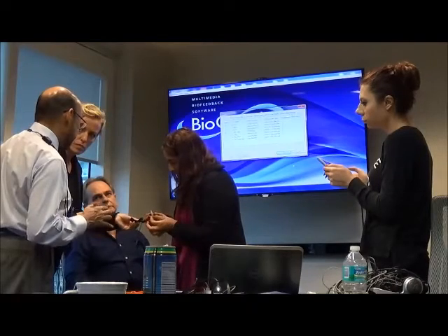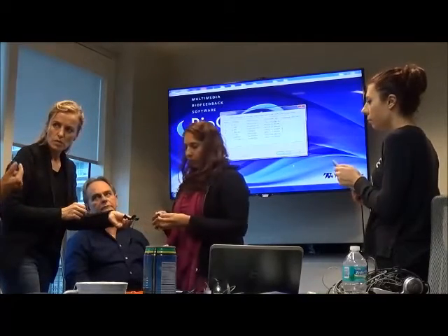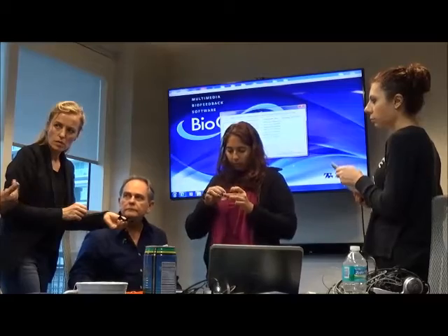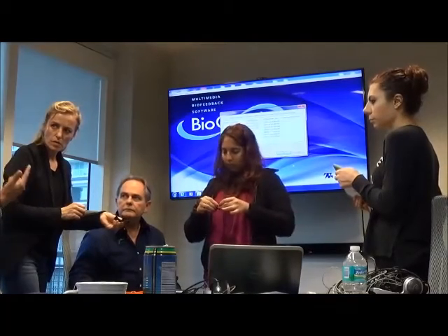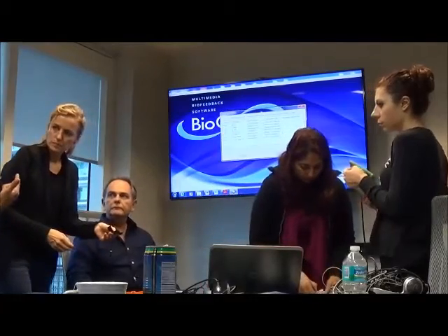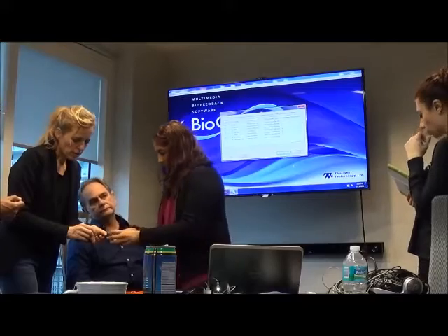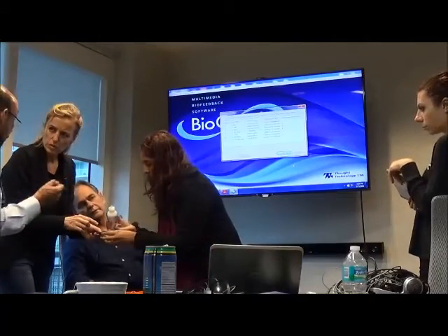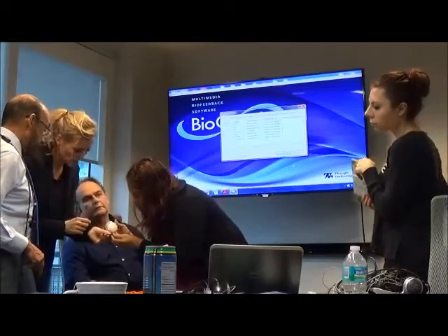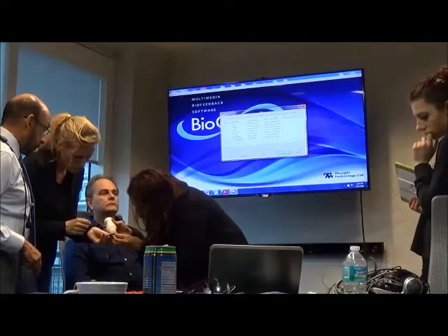It's a preparation which is silver and silver chloride. And this is a better conductive material. Oh, okay. So you have the base metal, and then you have a coating of silver chloride. And over time, that coating gets wiped off. Yes. And then it doesn't work as well. It still works, but it doesn't work as well.